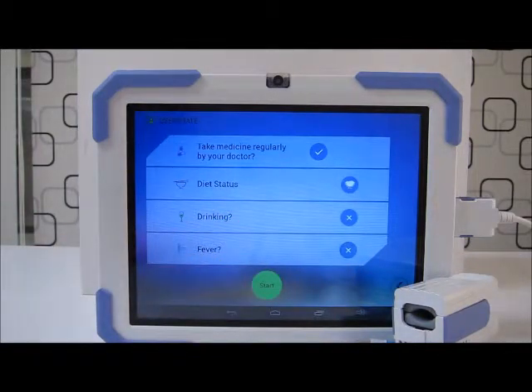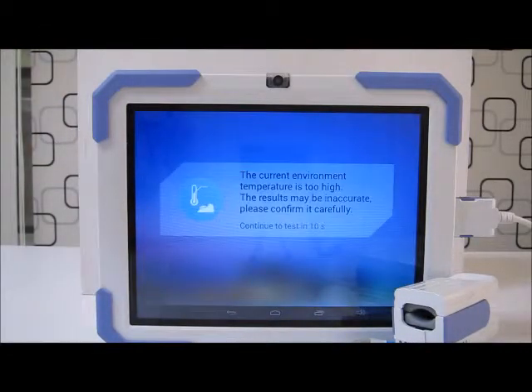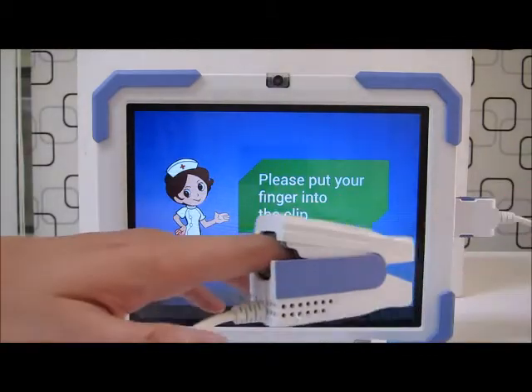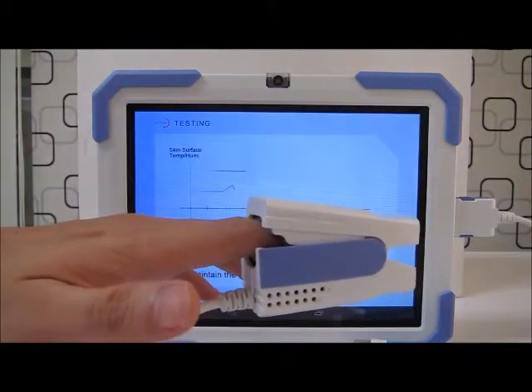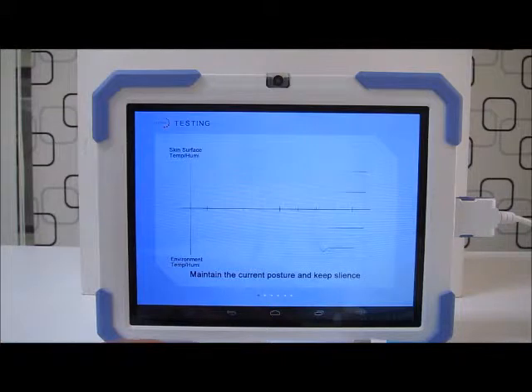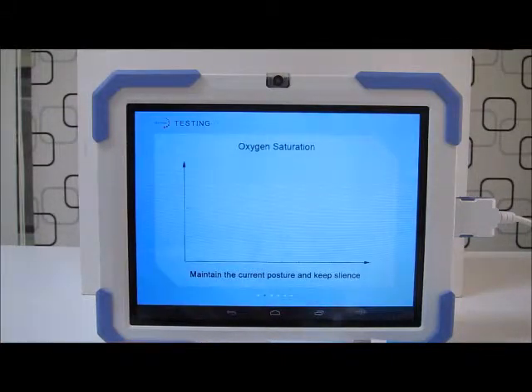Okay, so I'm ready to start a test. I'll be prompted to insert my finger. The test lasts for a minute and the user is advised to keep silent and maintain their current posture.